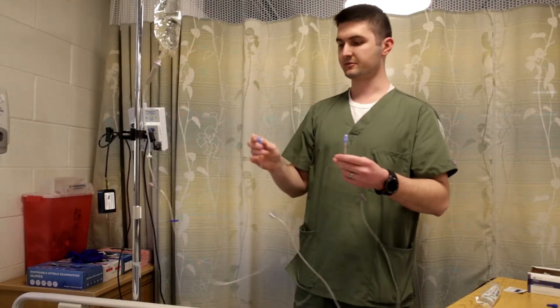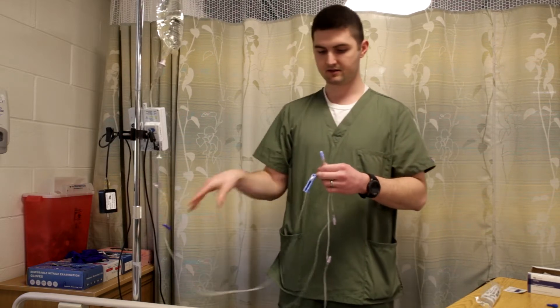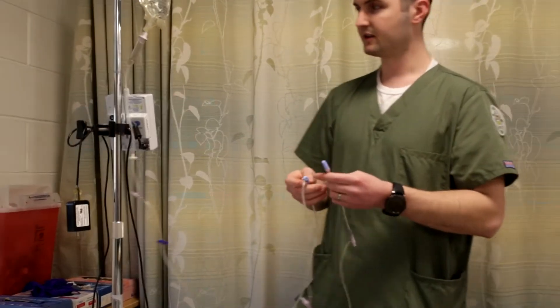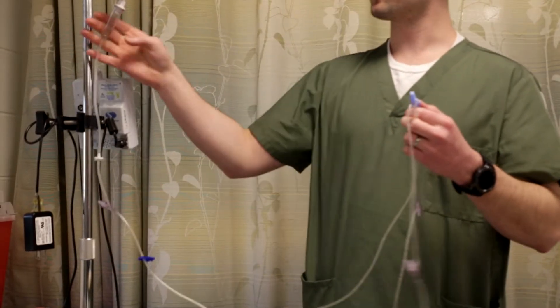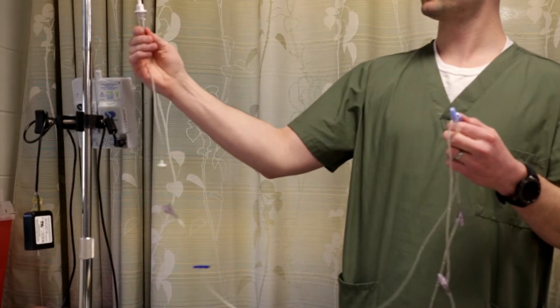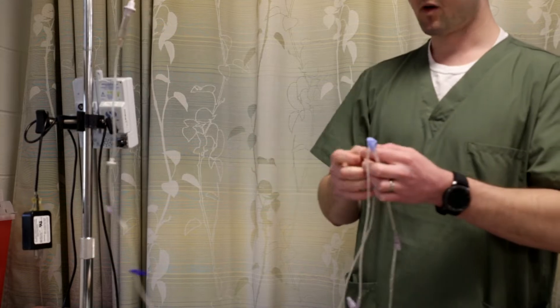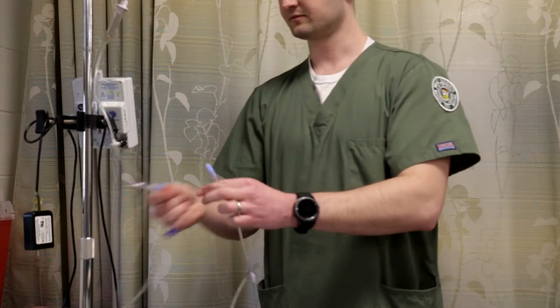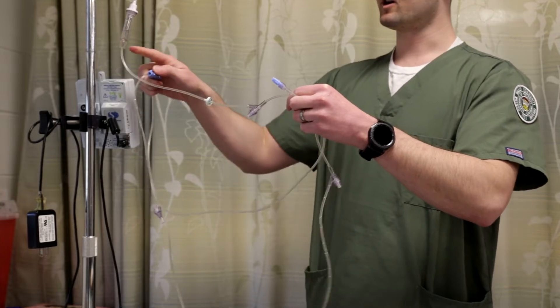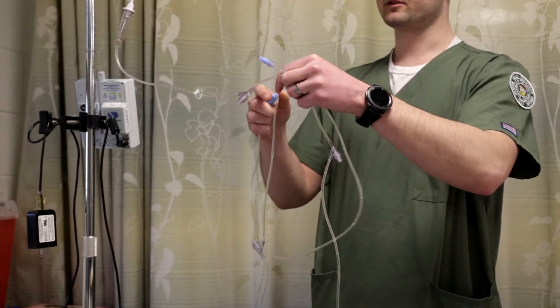Now that I've hung my bag up, I'm going to make sure that the clamp is clamped, make sure that this one is open, and that I still have my sterile blue tip on there. I want to prime the IV like this — make sure that you get the fluid up to the line. Before you open it, to get the air bubbles out the right way, you want to open it up and watch the fluid go through. The bubble will go out.